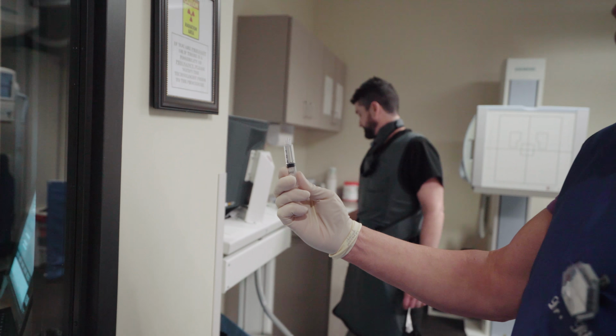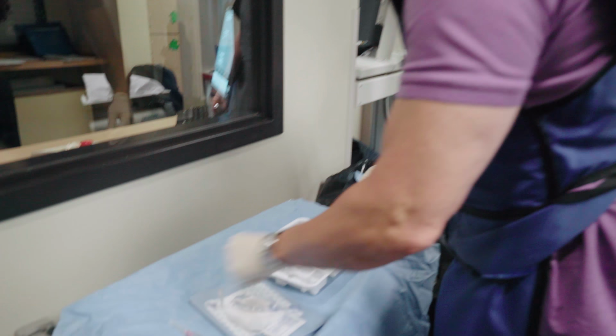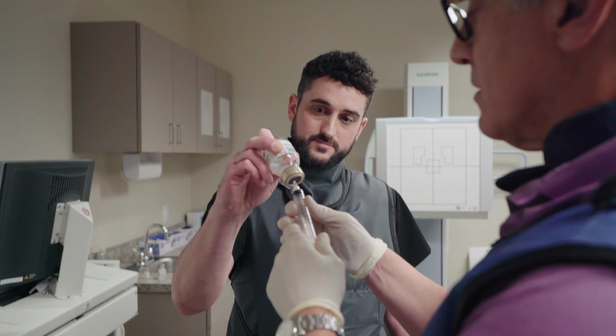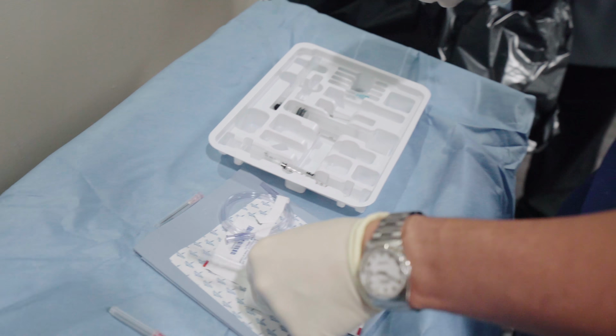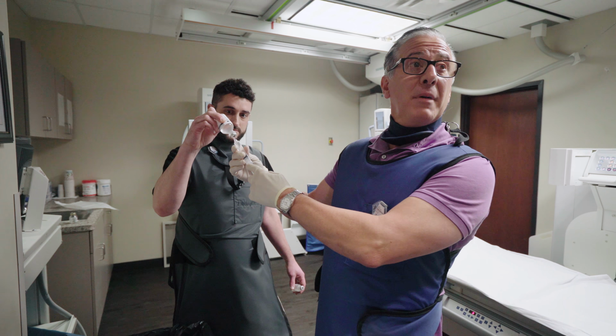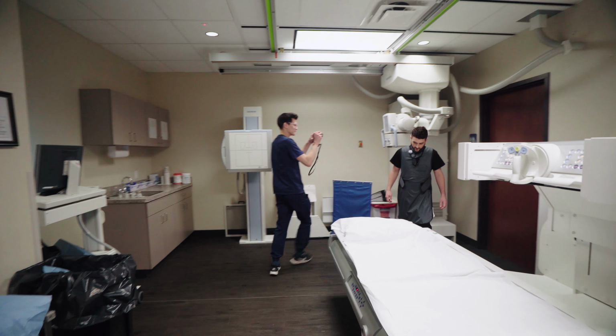This is lidocaine, to numb the skin, so it mitigates the pain of the injection. After all, we are putting a needle in somebody's skin and their groin, which can be very sensitive. Now, this is contrast to confirm that we are in the joint. You just have to keep track of what you're doing. It's sort of like making a recipe, if you will. Hey bud, we're all set whenever you are.